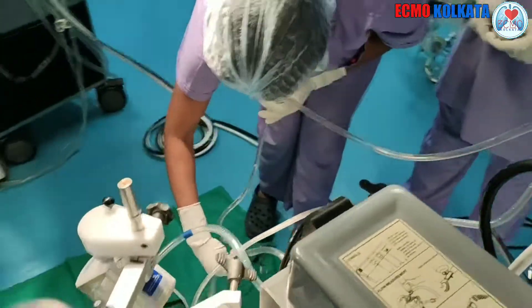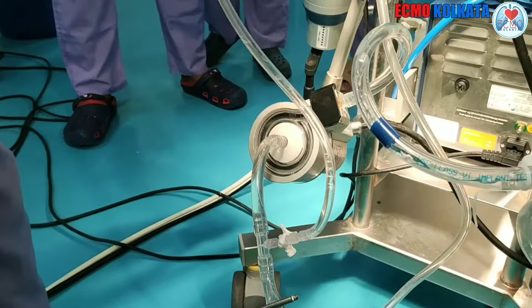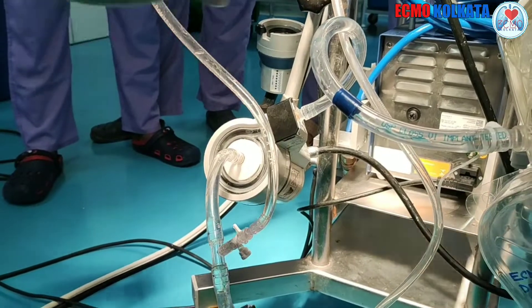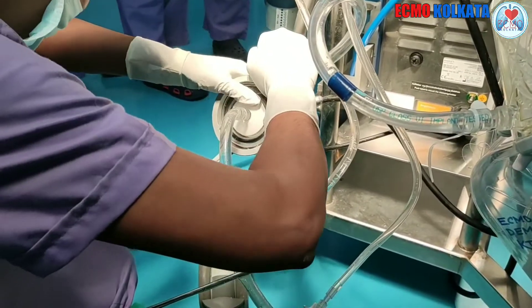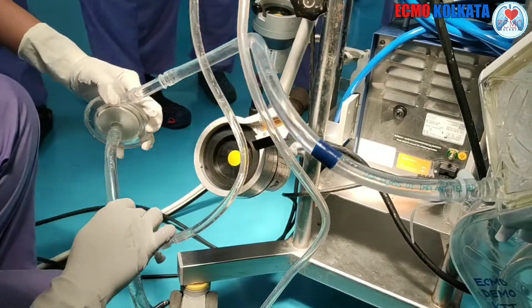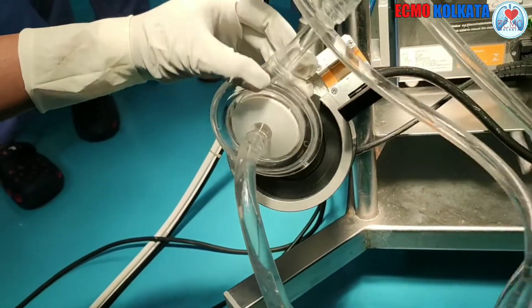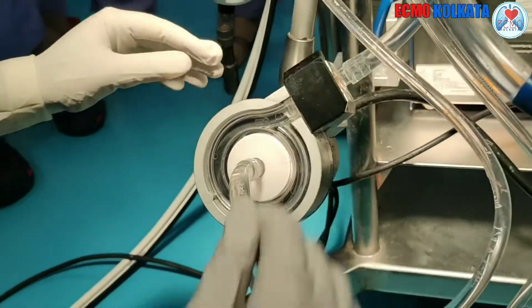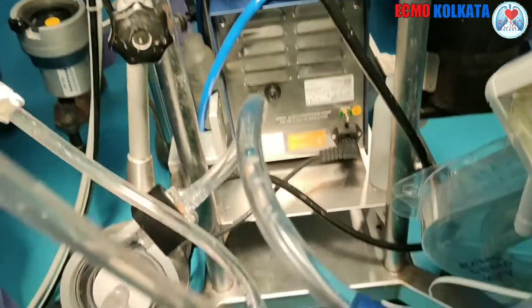A clamp is placed between the two quick prime ports. The three-ways are opened. The console is still not started. The priming is done now. The next step is to make the cone air free. The remaining part will be air freed by gravitation.